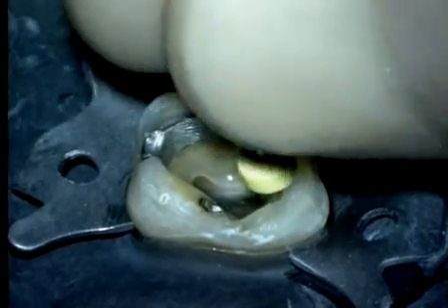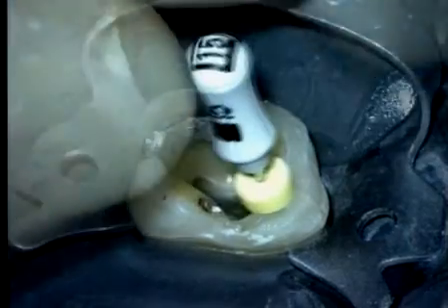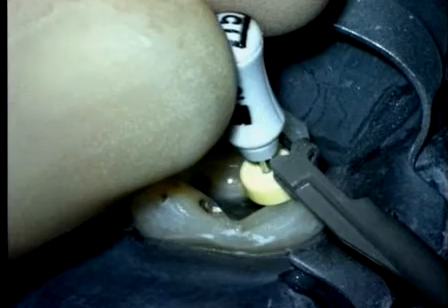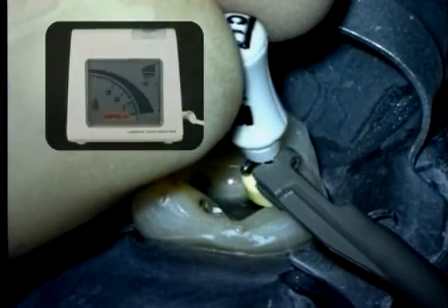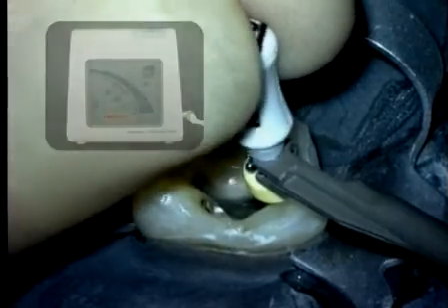When it's at length, it's wise to reconfirm working length, and I use the electronic apex locator. The lead lassos the shank of the file, and the reciprocating handle motion is gentle, and we just minutely move the file away from the terminus. Then the file is slid back to length. If we get a stable reading on the display unit of our electronic apex locator, we have confidence of working length and we can proceed on.